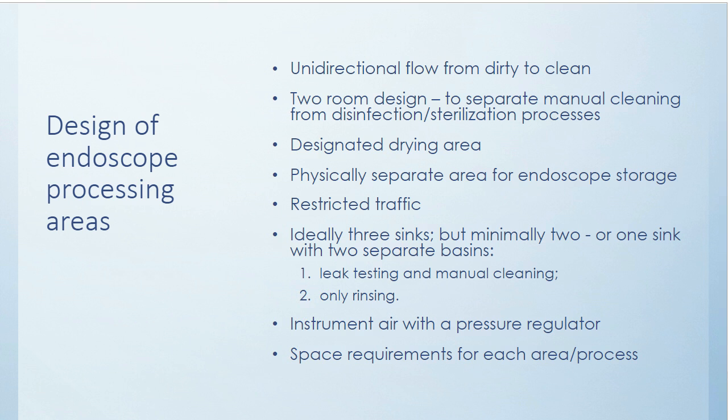You also have to think about, do I have proper space requirements? Do I have enough to do this cleaning? Do I have somewhere that I can put the scope to do an inspection on it and a cleaning verification? If not, use the standard to make the changes that are necessary while having that support. With that, John, I'm going to turn it over to you.